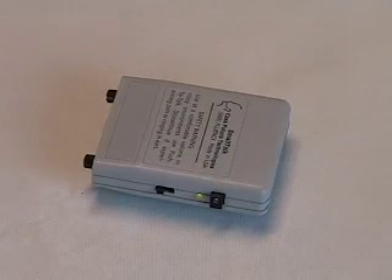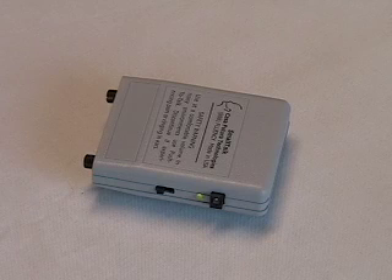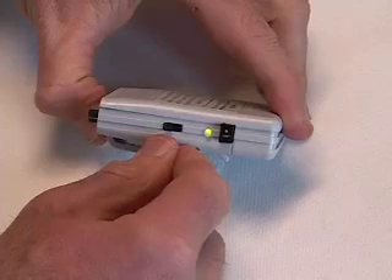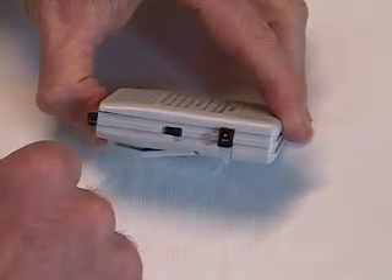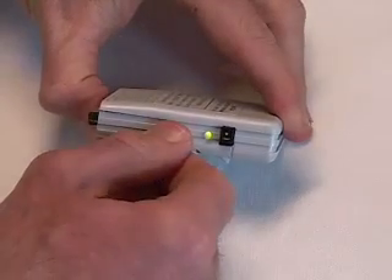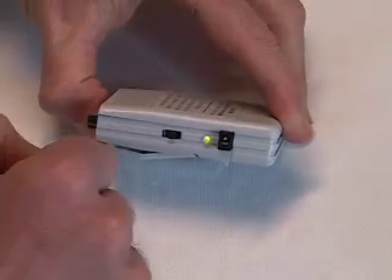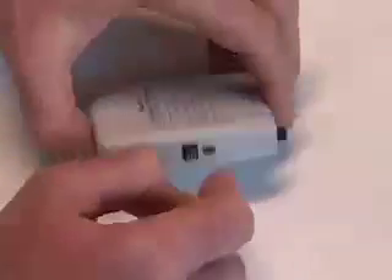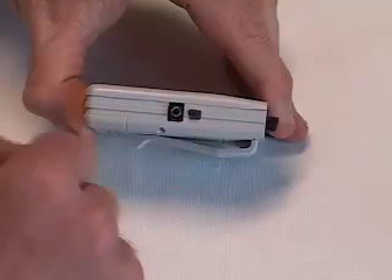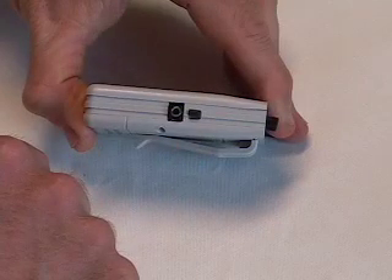To use the Smalltalk in a noisy environment, switch to push-to-talk mode. Note that the power switch has three positions: right means the switch is off, left is on, and middle is push-to-talk mode. In push-to-talk mode, the sound is off until you push this button — pushing the button instantly switches the sound on.